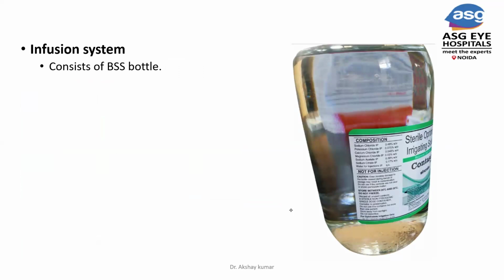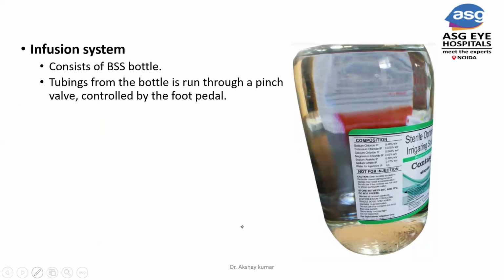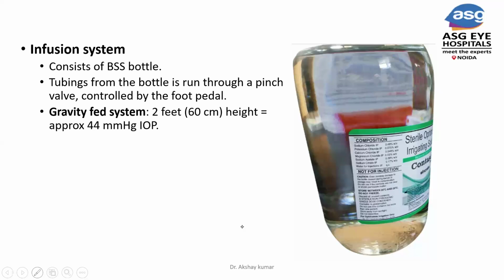This is the infusion bottle of balanced salt solution. Sometimes people ask in an MCQ, or sometimes in a viva, what is the composition of BSS. You can remember this: sodium chloride, potassium chloride, calcium chloride, magnesium chloride, sodium acetate, and sodium citrate.